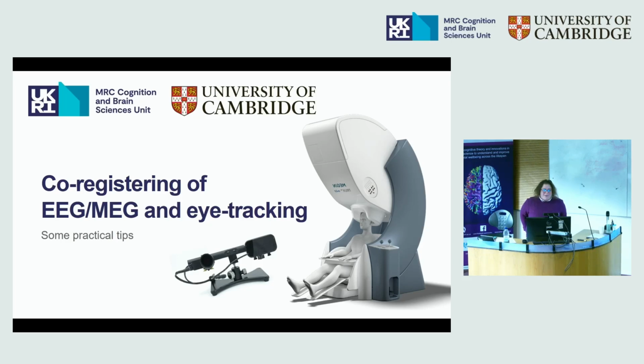I'll borrow Saskia's comment that it's method day and not results day, so I'll also talk about how I'm dealing with analyzing co-registered EEG and MEG and eye tracking data, and no results, sorry, so just methods. So why I'm presenting this today is that traditionally in EEG and MEG, we ask our participants to keep their eyes still, and this is because the eyes cause a lot of noise in EEG and MEG data.